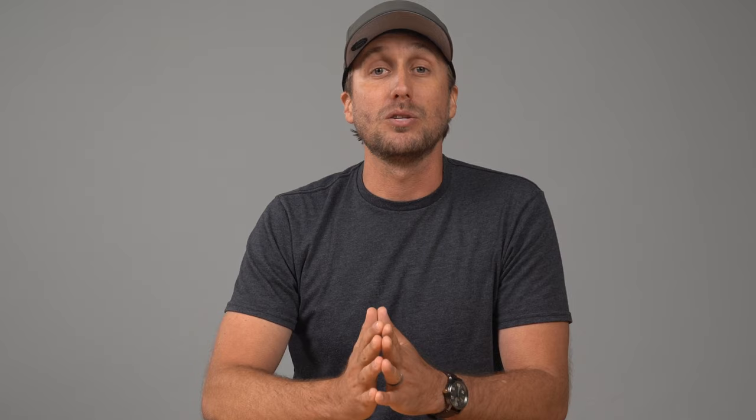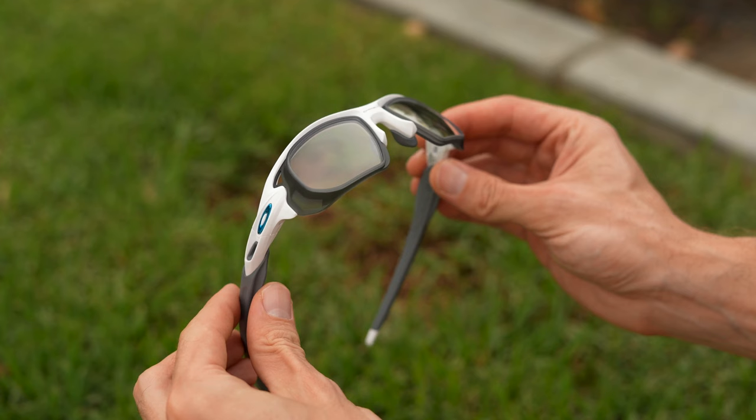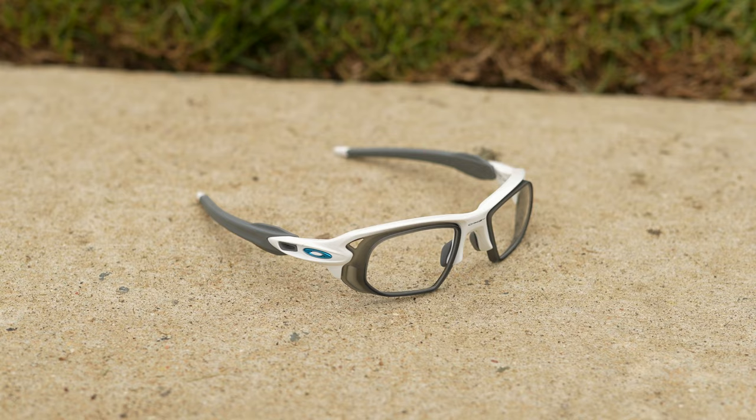I say up until now because we at SportRx have finally come up with a solution. This is the Flak RX Dock. The dock is made of a resilient and highly durable TR90 nylon that, when installed, feels so secure you wouldn't even guess that it detaches from the frame. We also have venting holes near the outside temples to allow more ventilation and airflow that combats fog buildup on the backside of the lens.